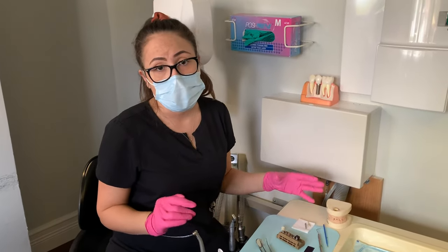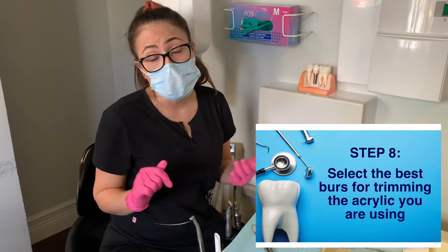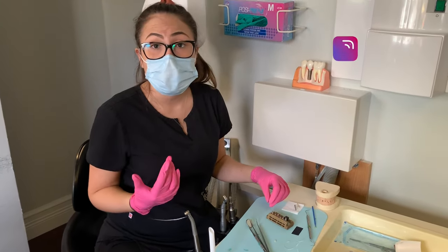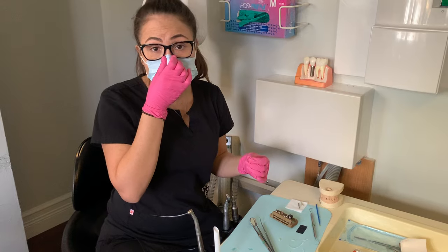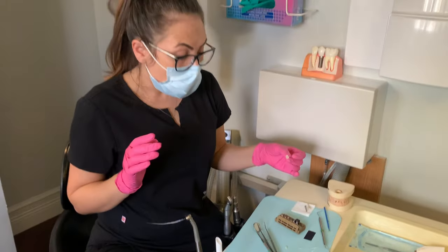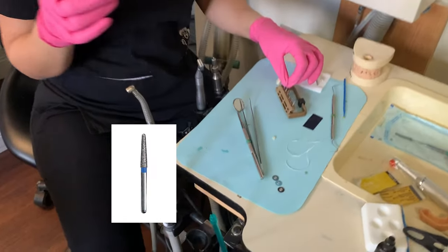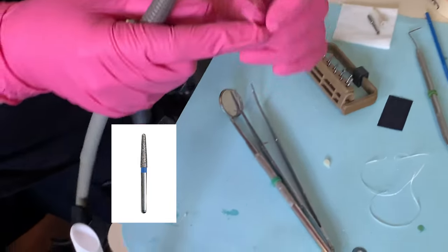Now we are ready to shape our temporary. Depending on the material — if it's regular acrylic like we learned in school, you might have to use an acrylic bur. But personally, I prefer the high speed just because it gives you a better finished look, it's faster, and I feel like I have more control. With this material, I can use the high speed no problem. For the shaping, what I use — which is fast — is the diamond. I start with a diamond, just a regular diamond for crown preps.